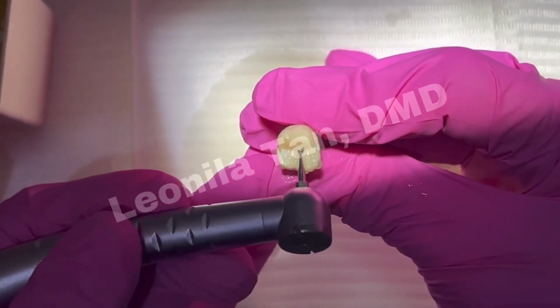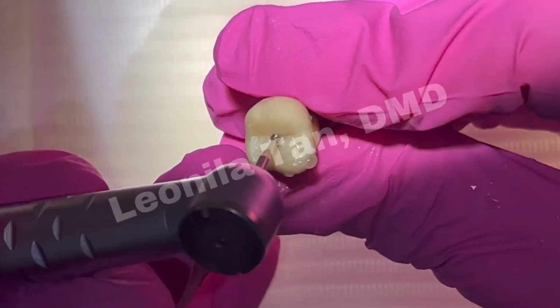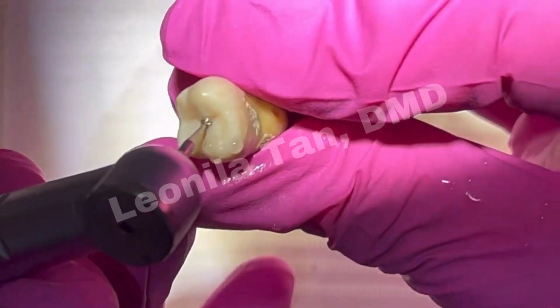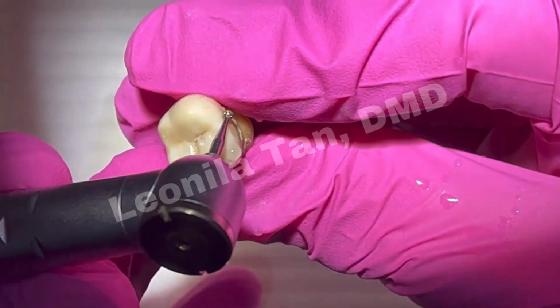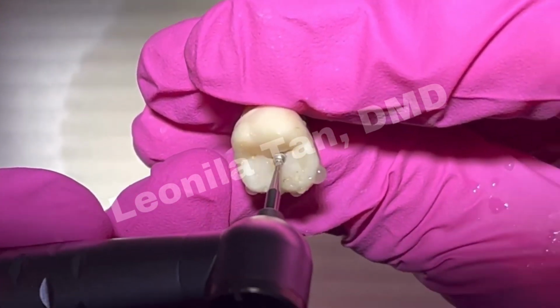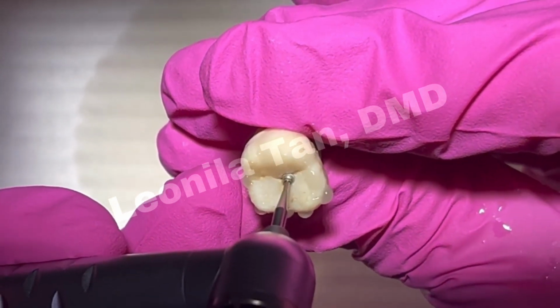Notice the orientation. It's directed towards your palatal. It is slightly angulated only, going towards the palatal. Never direct it to the mesial or to the distal. So let's start. So again, at the middle of the central groove.